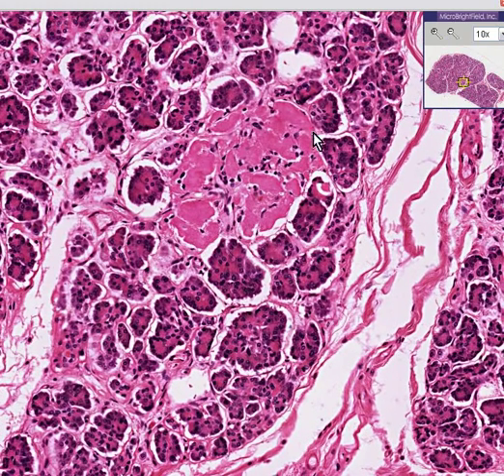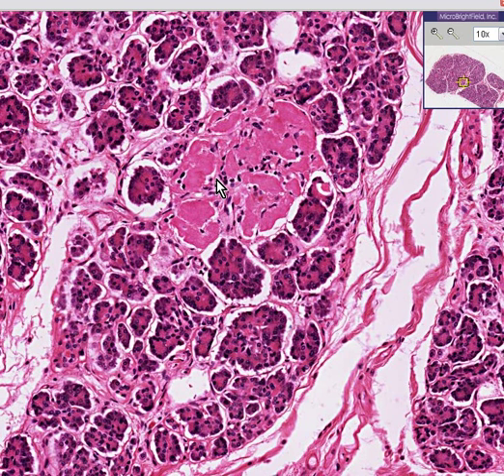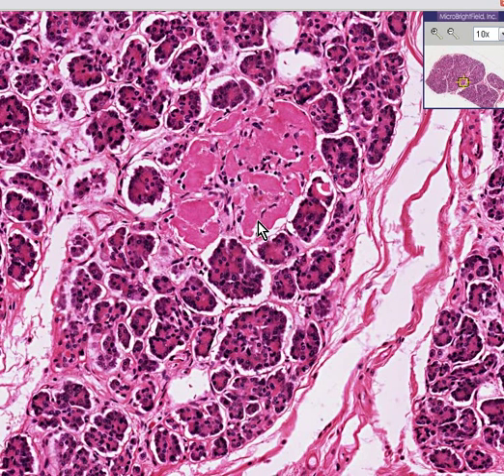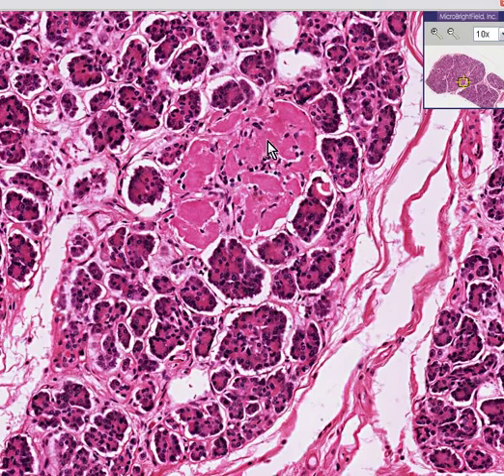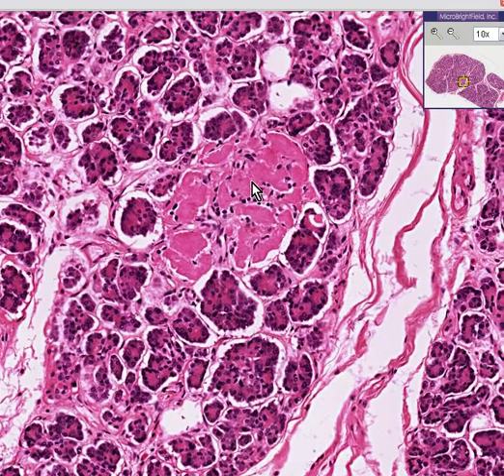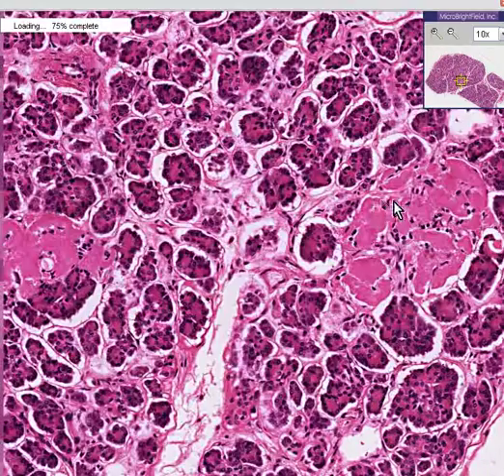Now, what is this? This looks like a fairly well-defined focus of what looks like predominantly fibrous tissue. This used to be an islet of Langerhans. It probably still is, but now it is what we call hyalinized — it no longer has cellular differentiation. It is basically all scar tissue.